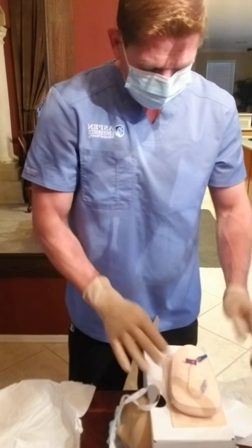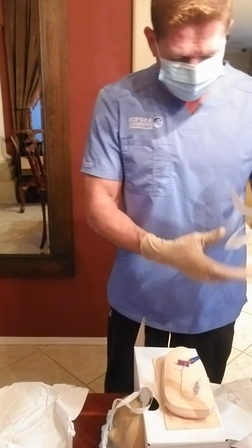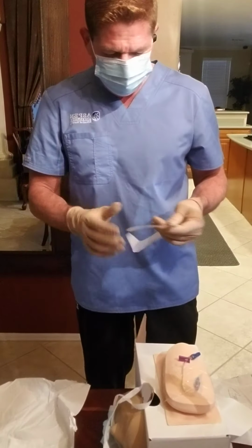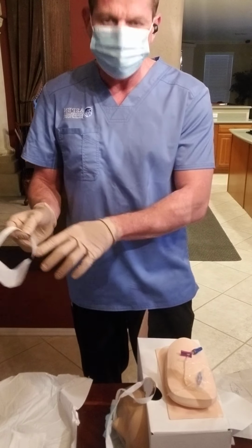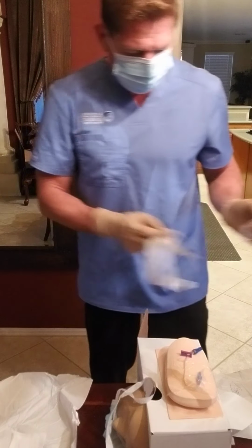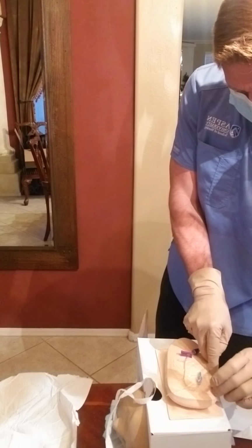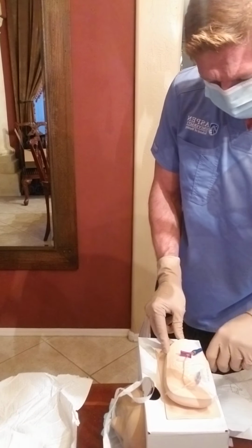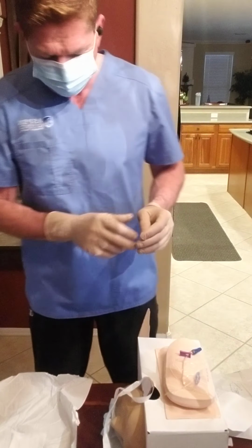Okay. So I have that down. I'm going to, with a pen, write my initials, date, and time of when I did this. So I've already done that. And then I'm going to stick it here on the patient so that whoever's going to come after me knows when that was done. And it's supposed to be done every 7 days.